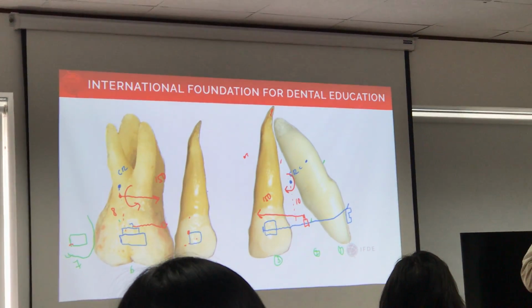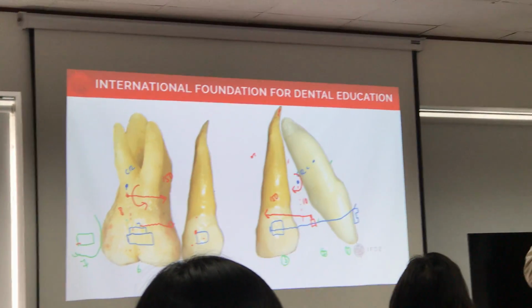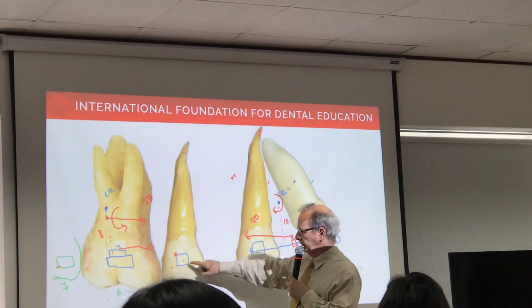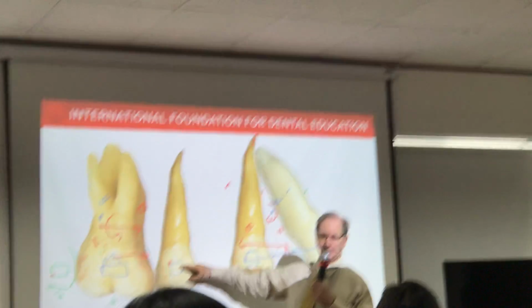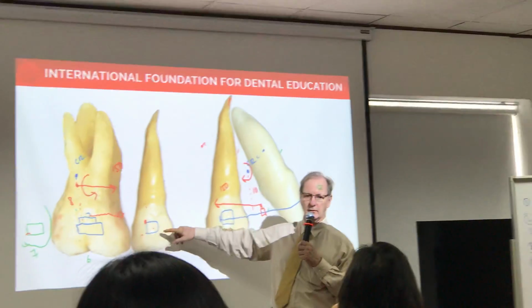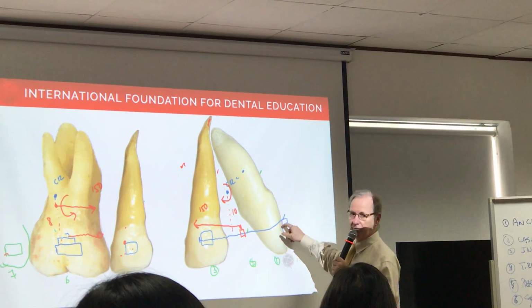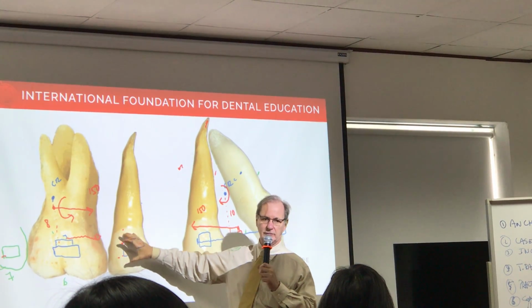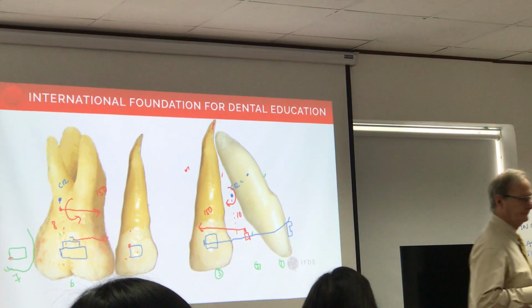Easy. Really? Yes. You must use small wire. Because if you put a fairly big wire in there, and you put a curve of Spee, the wire comes down to here, you have to deform it to get it in there. It's not easy. If it's easy, it's because the wire is too small. So it's there, the big 19x25, whatever it is, you have to lift it and put it there. The first thing it's doing what to the bracket? Yeah, I understand what you mean.